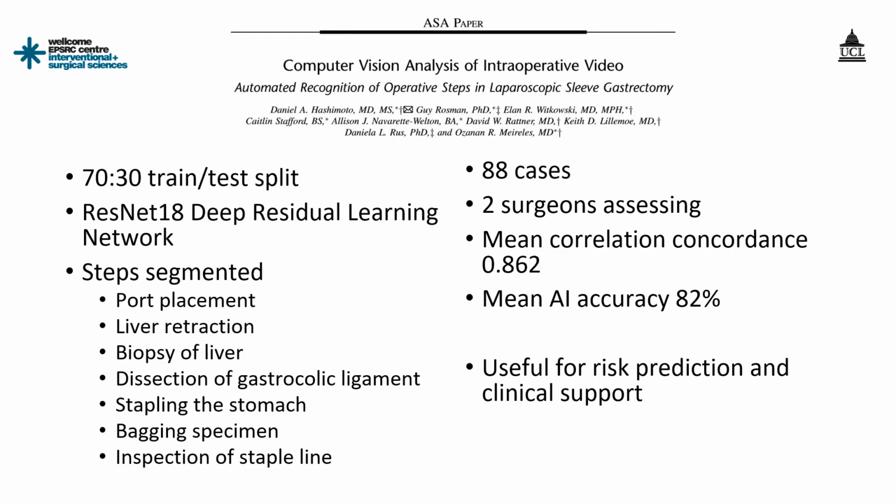an example in real time of cataract work. Unfortunately, I've gone past that slide. So in effect, we can look at cataracts, or we can look at gallbladder operations, and in this case by our friends from Harvard, looking at laparoscopic sleeve gastrectomy.